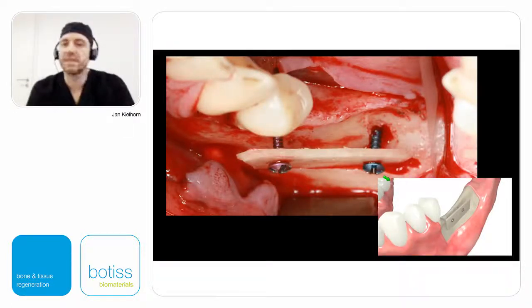To show you the classical case is, of course, the mandible posterior. That's a classical case, also a very good case to start with. We got a triangular shape because we got the resorption very thin at the top, and it gets wider at the bottom. So we place the plate in a distance to the original bone, the distance on the planned implant. So if we want to plan the implant 3.3 or 4.1, and we want to have 1 millimeter more left and right, of course, we will place that in a 6 millimeter distance. So that is that we exactly build up the geometry and the dimension we need.